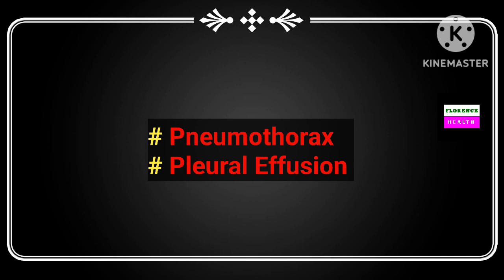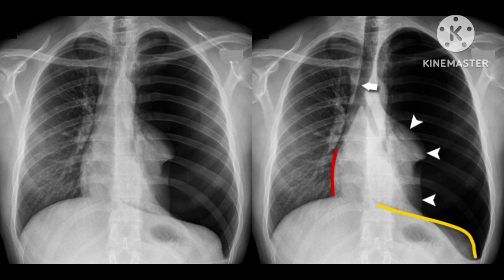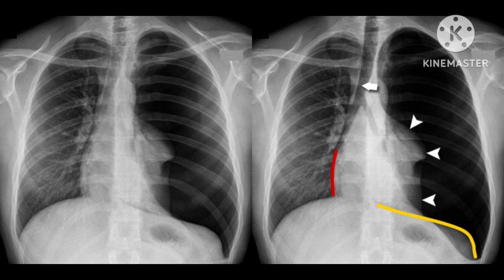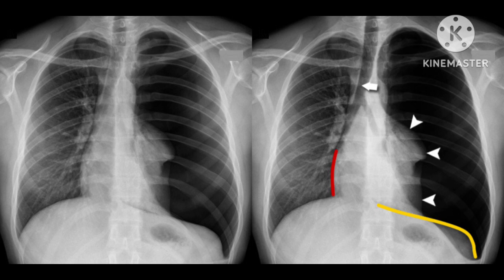Let's see how to recognize pleural effusion and pneumothorax on X-ray. Pneumothorax means air inside the pleural cavity; pleural effusion means fluid inside the pleural cavity. This slide shows the left side of the chest is more black in comparison to the right, with loss of its bronchovascular markings. The color of the left side is similar to room air, and bronchovascular markings visible on the right side are absent on the left. If one side of the lung is abnormally black with loss of bronchovascular markings, it is in favor of pneumothorax.